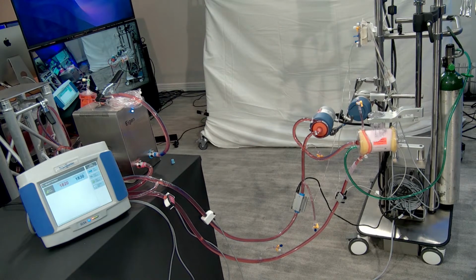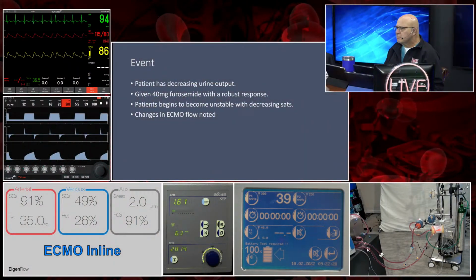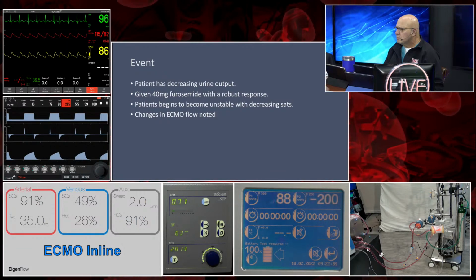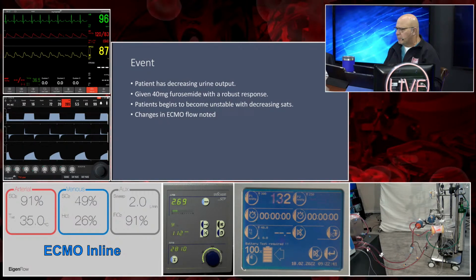So it will try to pull, it will create a negative pressure, the line will collapse, the volume problem will solve itself because the pump has stopped, and then it will open up again. And that's why you see the changes in the flow. It's trying to flow what you have set it at, but it does not have enough volume to do so, which will cause the chatter. Now, let's talk about, so go ahead and bring the slides up.